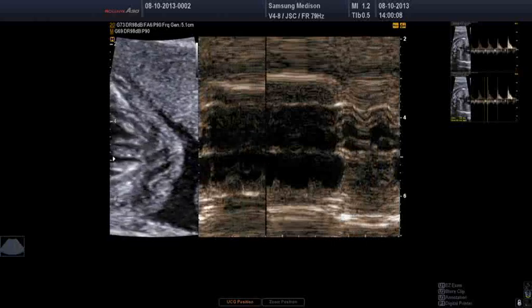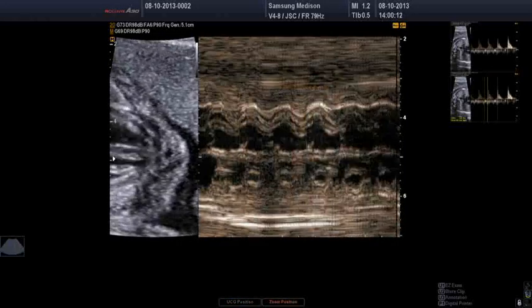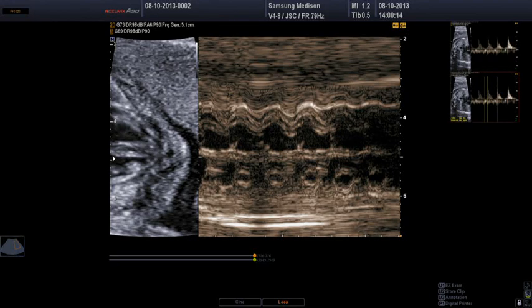Yeah, my 2D image moved away from there, that to do for our measurements. So in here, although the 2D images come out of the screen, this is the left ventricular free wall and the septum. So you would identify here the movement in systole when the heart's contracting, diastole when it's relaxing.